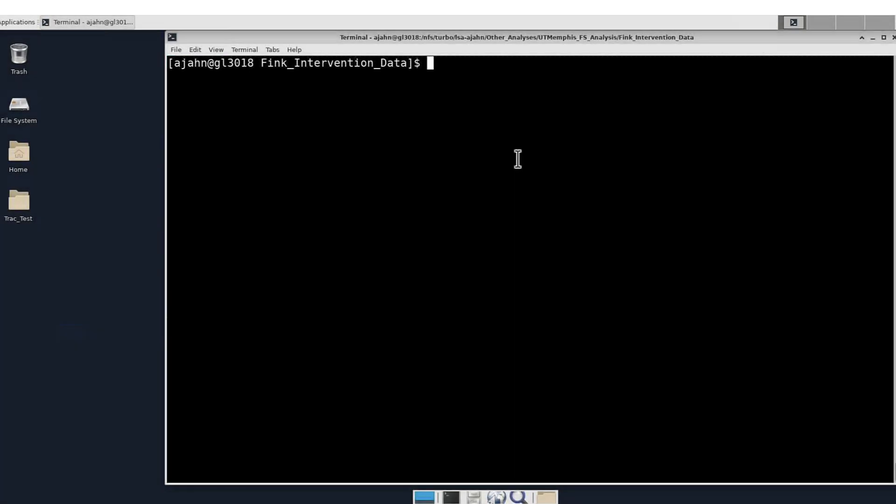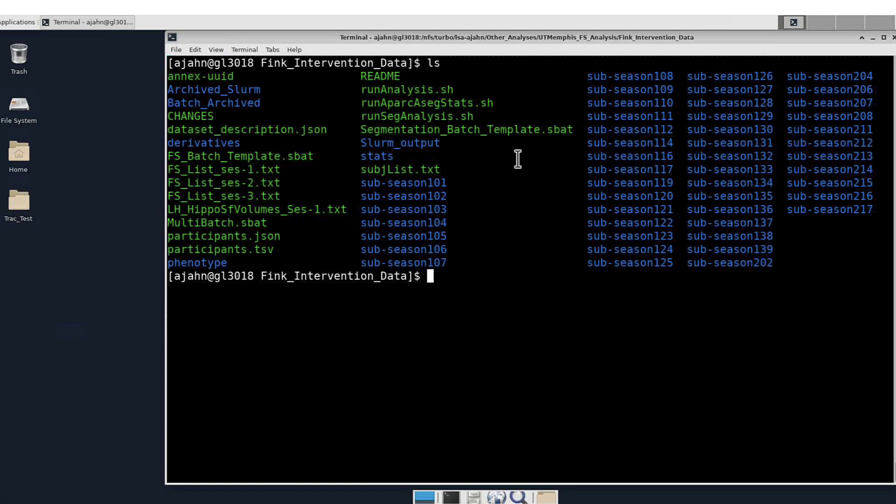This analysis can also be run on a supercomputing cluster by using something like the following template.